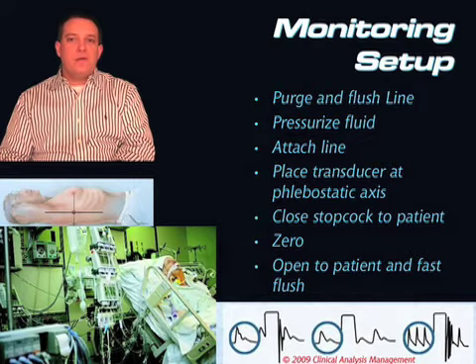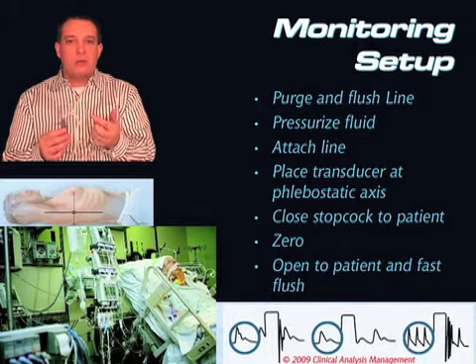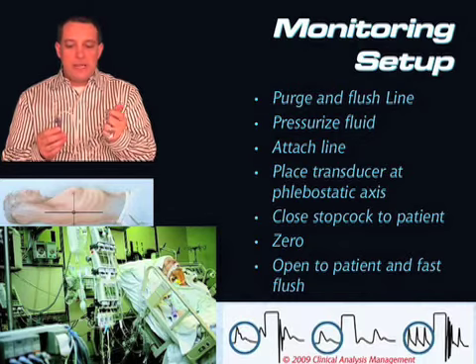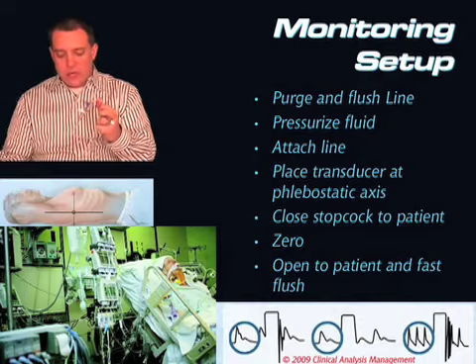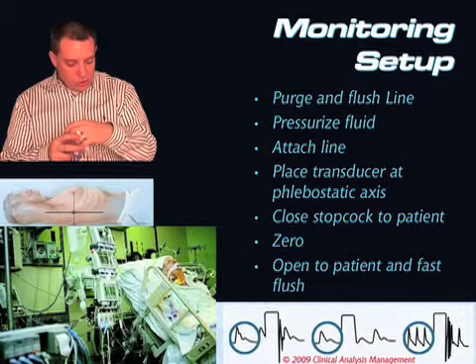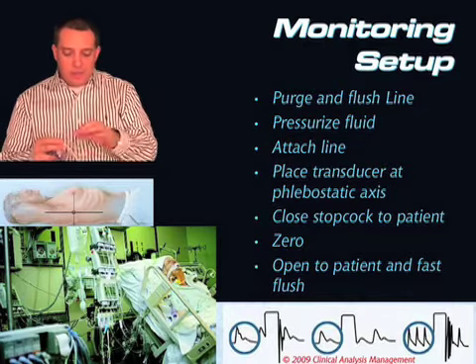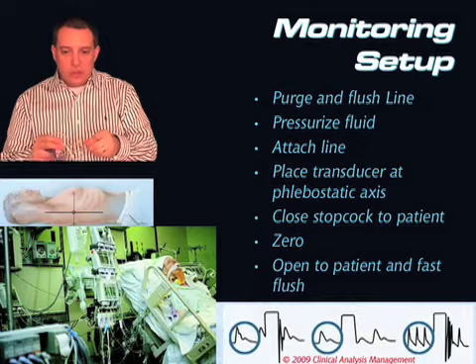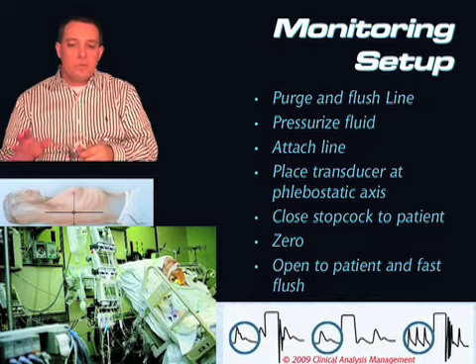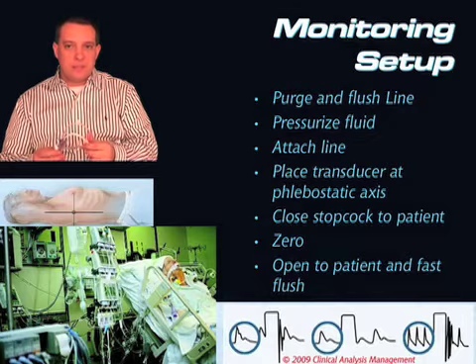If the system is overdamped, like in that middle example, that tells us there is resistance or blockage somewhere. So we need to go back through our whole setup and make sure all of our stopcocks turn the way they're supposed to. Is our pressure bag at the pressure it's supposed to be at? Do we have any kinks or bends in the tubing? If so, we need to clear out those blockages, and that should stop an overdamped system.